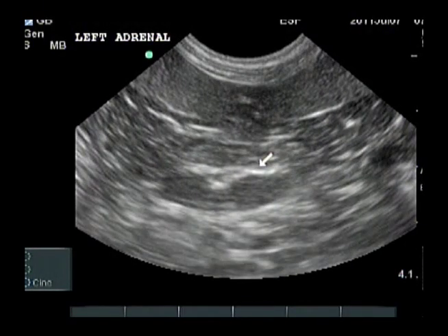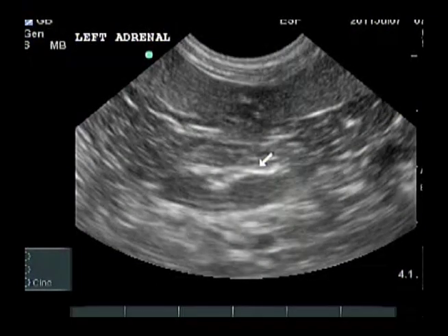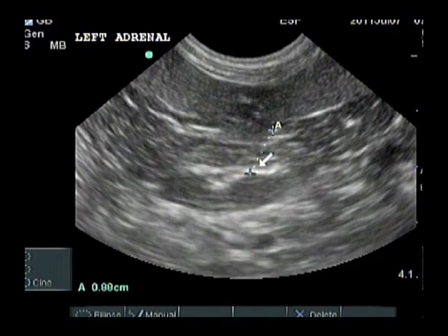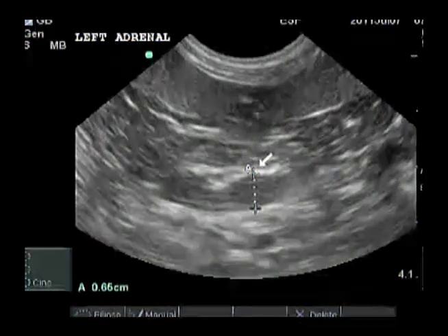In addition, if an animal is struggling, you can use both hands to stabilize the transducer and then press the freeze button and use cinematic loop to scroll backwards to find an acceptable image.